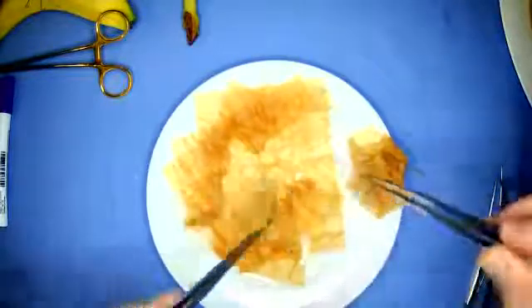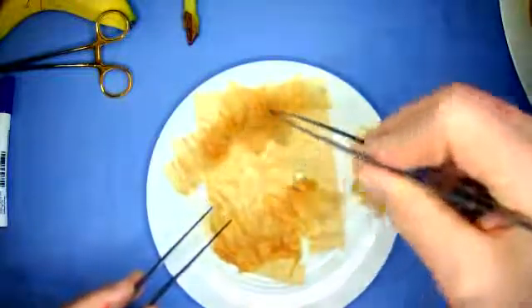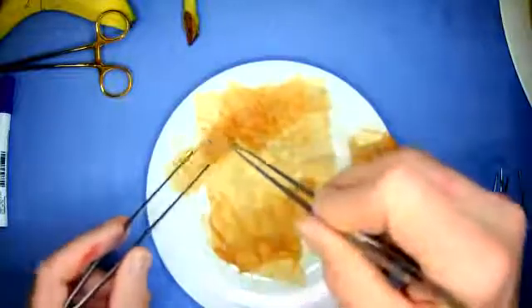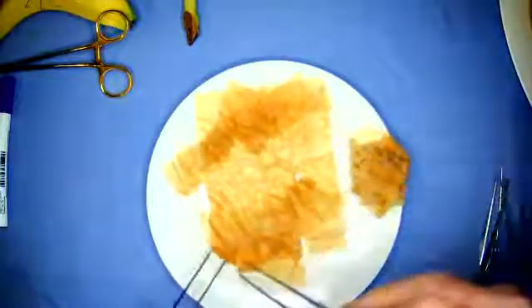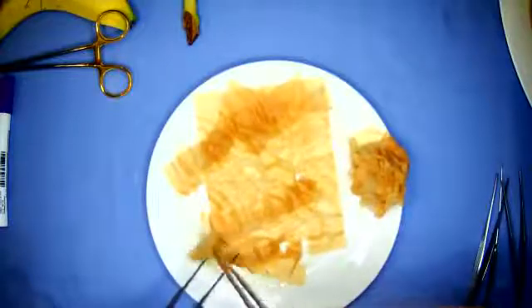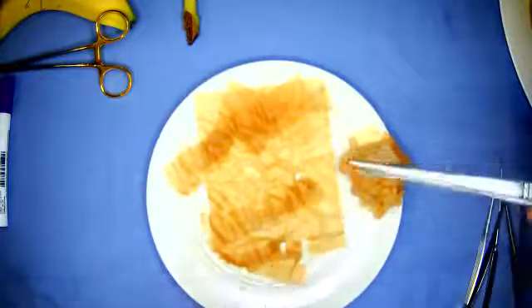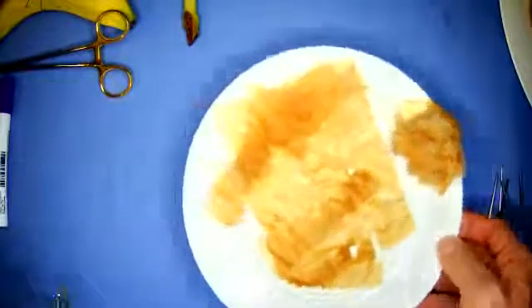You see, if I grab it or stab at it, it just tears and pulls off. I had 5 layers here. I'm almost down there, but I hope it has demonstrated the principle of how you can practice your simple, delicate skills, forceps at home. So there's one other aspect to your forceps that I'd like to point out.